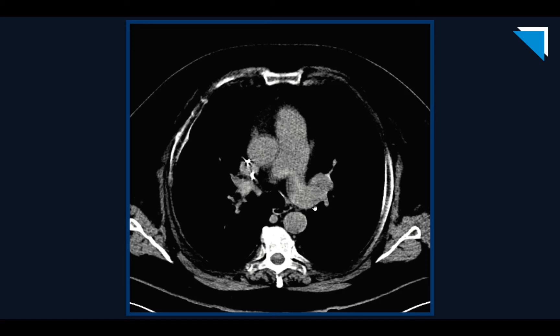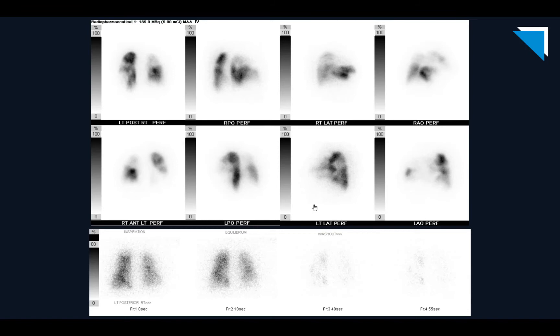The patient went on to a VQ scan because they couldn't get intravenous contrast for the CTPA. These are the normal projections of the perfusion examination along the top two rows, and the ventilation examination in a posterior projection along the bottom row. Starting with the ventilation examination — posterior image, left lung and right lung — other than the left lung demonstrating relatively diffusely increased radiotracer activity compared to the right, there aren't any focal defects in either lung during the inspiration or equilibrium phases. During the washout period, there are some areas of air trapping within the left lung, but otherwise fairly unremarkable.